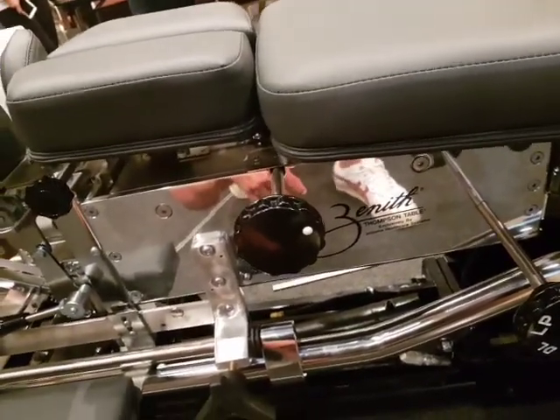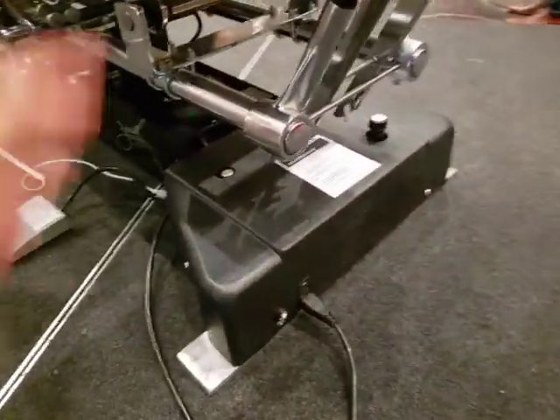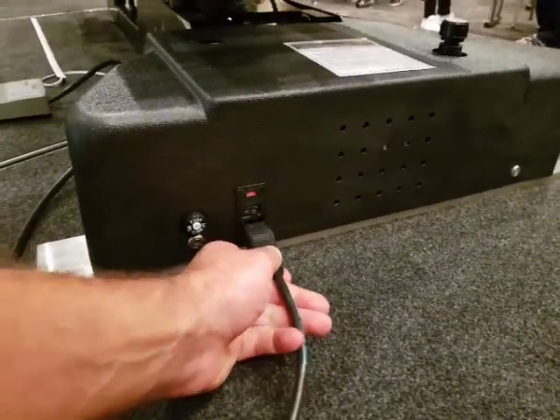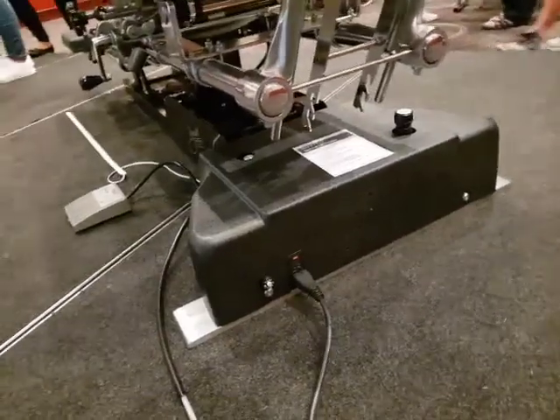The table will only work when it's plugged in — it uses a kettle cord that plugs in around here. Good luck and enjoy your table. Any questions, go through the Zenith page, and there are other videos available that will be able to help you.